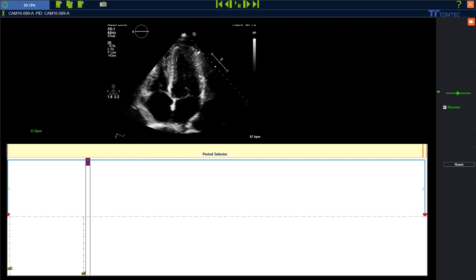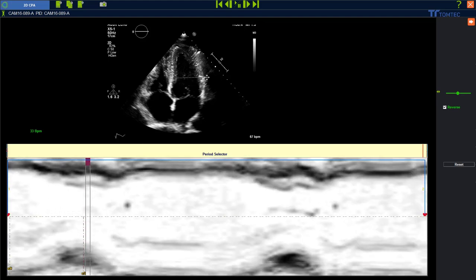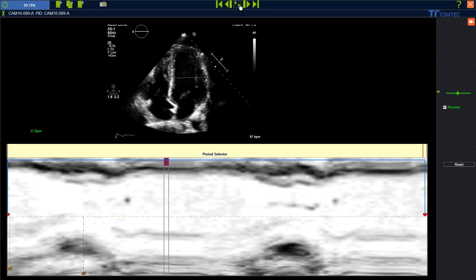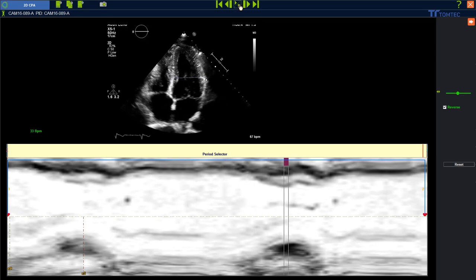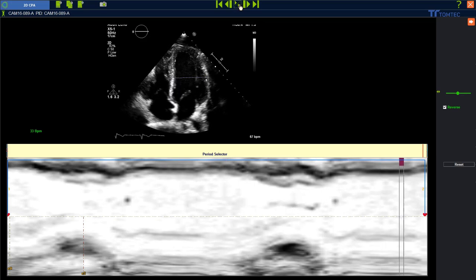We can use M-mode as a helping guide. Go with your mouse into the cine loop — you can see a pen appears. Left mouse click, left mouse click, and right mouse click to confirm. Play the loop to see how many heart cycles we have.